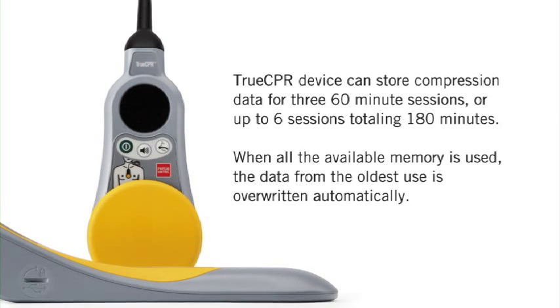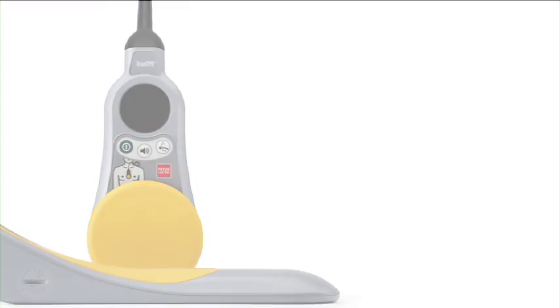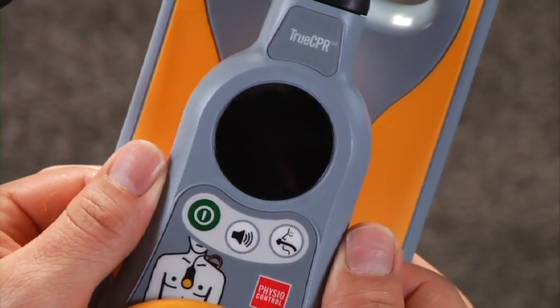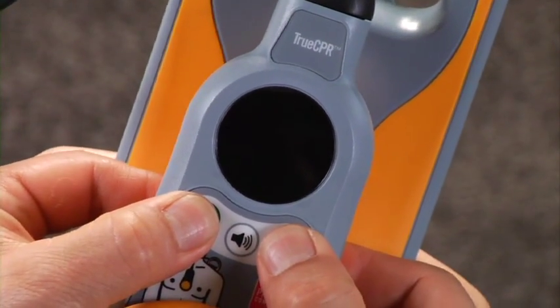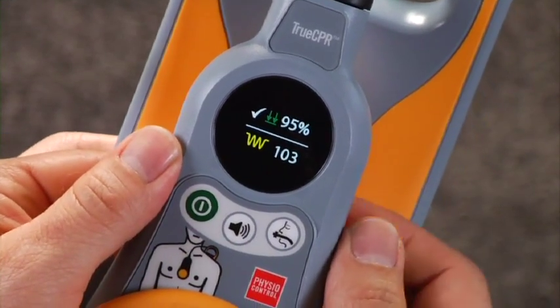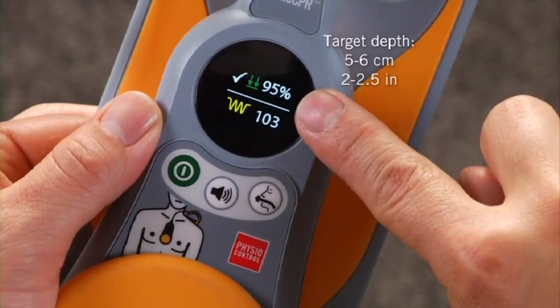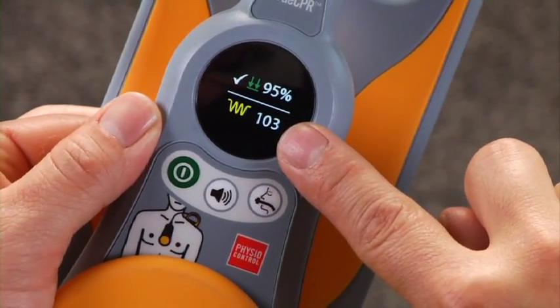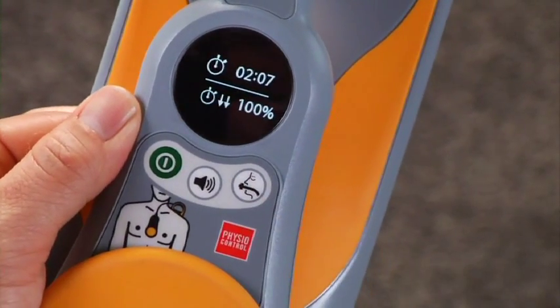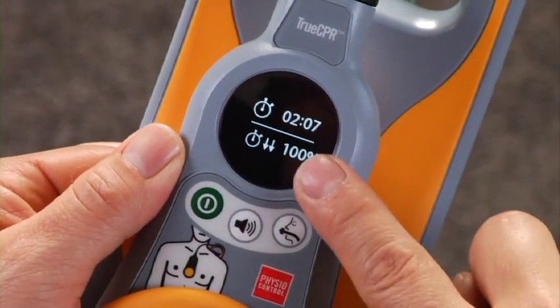There are two ways to review the data. First, on the device itself, you can see a statistical overview of the most recent event. Start with TrueCPR turned off, then press the airway and power buttons at the same time. One screen shows what percentage of compressions achieved the target depth and the average rate of compressions per minute. Use the mute button to toggle between screens. The other screen shows the total event duration and how much of that time included compressions.